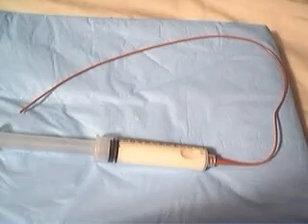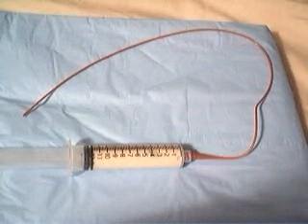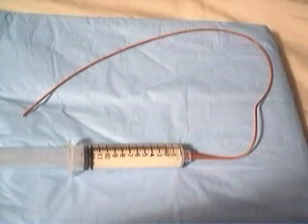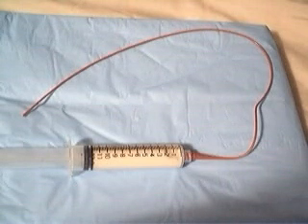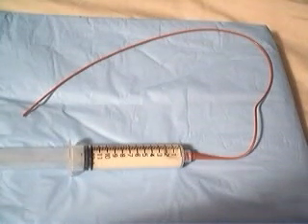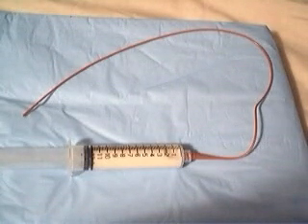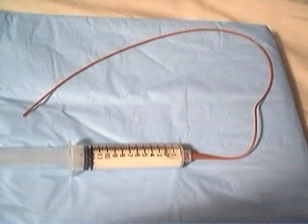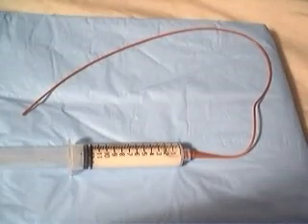The 12cc syringe is filled with warm formula, tested just like you would for a baby, against your wrist. I'm using the Esbilac with goat's milk 50/50 with Pedialyte still. We have a little postage scale set up next to where we're going to operate. We're going to weigh the puppy first. He's weighing 2.5 ounces because that's the little boy, number 1.